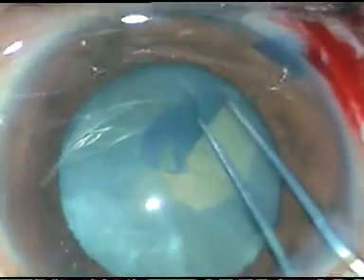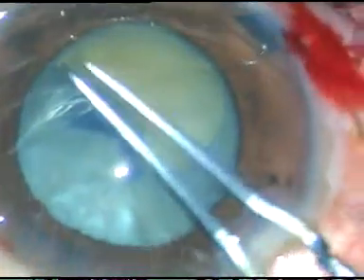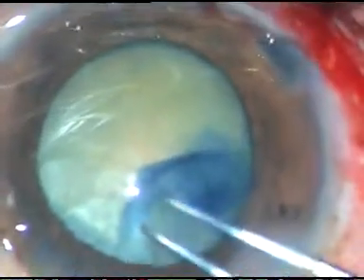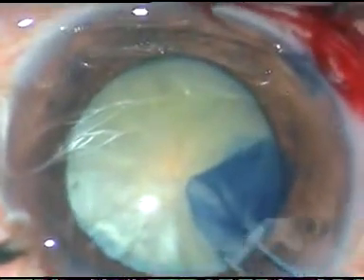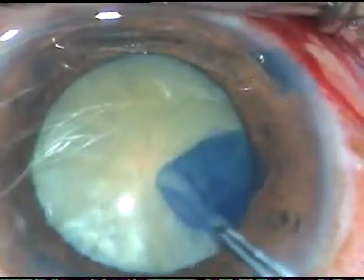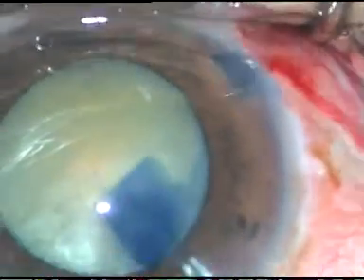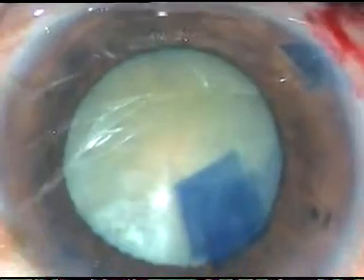But there was mild convexity of the anterior surface of the capsule. See what happens at around the sub-incisional area — just in front of the main incision, the rhexis has gone to the periphery. I pulled it towards the center, but it didn't come. And since I can't see the rhexis margin, I know I should not pull it vigorously.